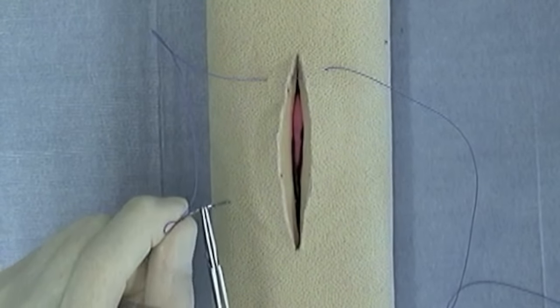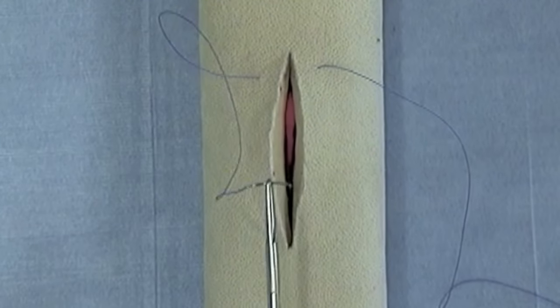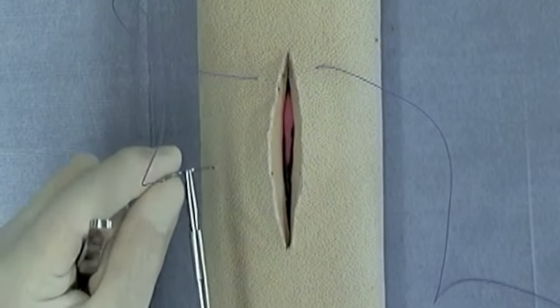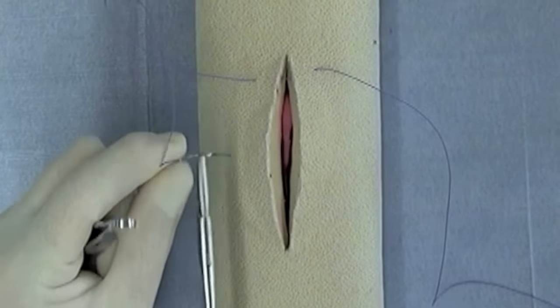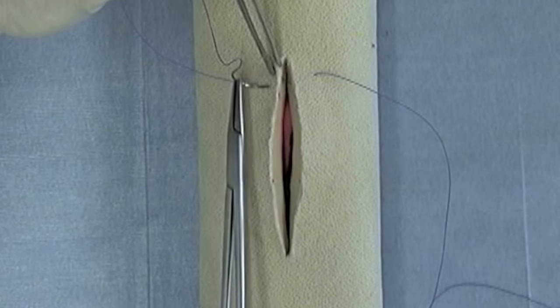So the first suture bites are taken in a forehand direction. You then reverse the needle, set it at a similar location on your needle holders, and then you're ready to do the near bites.